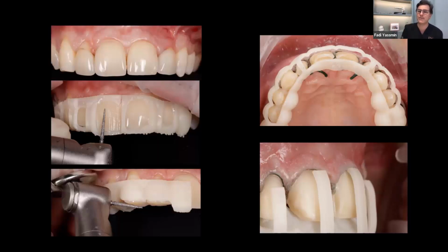It's these little gems, little tools. And this is what digital dentistry is about. The fact that you can print these tools that better your clinical outcome is insane. And there's so many softwares out there, so many designers, so many places that can do this stuff for you and send you the file and you print it.